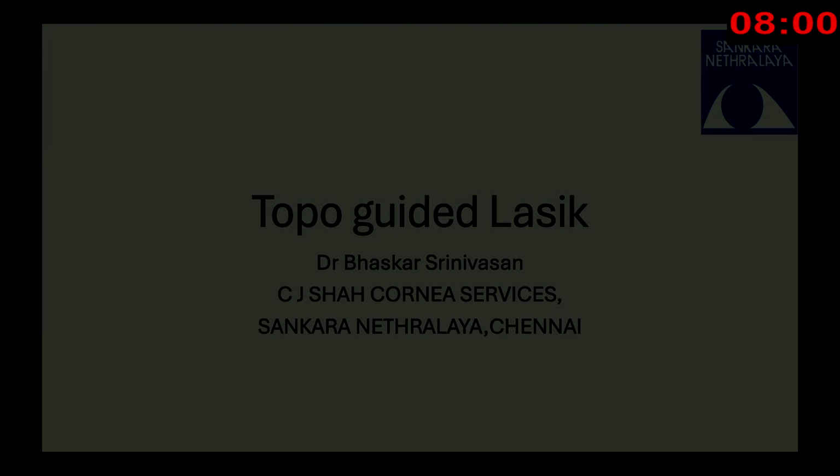Probably soon, I think, from Narayana Nethralaya they are going to come with a biomarker kit. So if you take out the tear fluid, then you can do the test, and you'll get a lot of relevant points on that. Depending upon that, you can plan which treatment the patient is suited for.